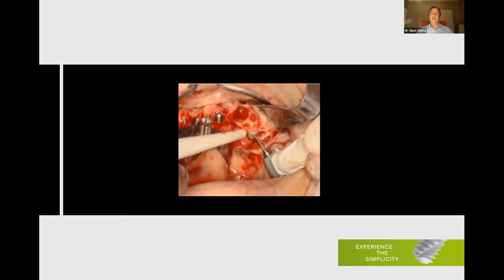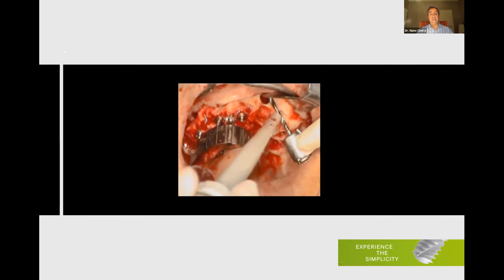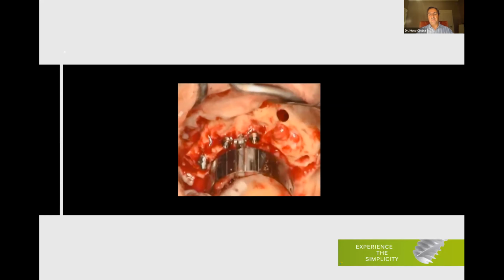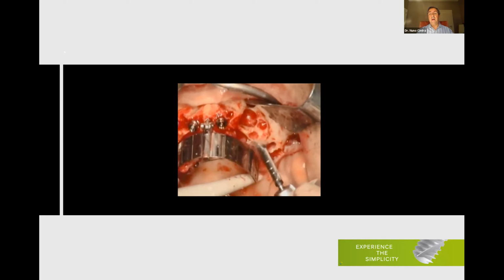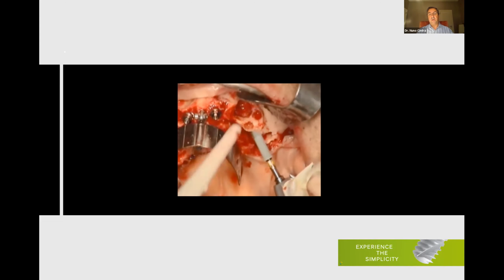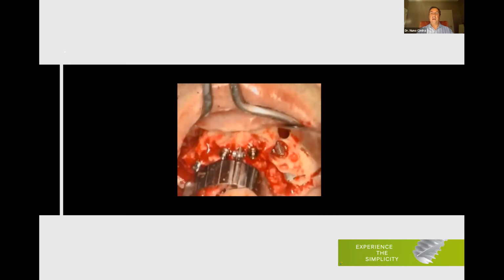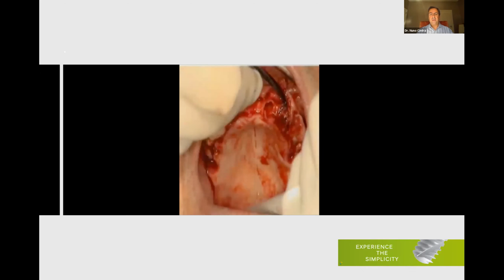And again, sometimes we need longer implants to do so. Sometimes to go through lesions, 16 or 17 length implants are not enough. We need 18s or 20s. As in this case, I'm using an 18 implant. So 45 degrees through the lesion. And when I say through the lesion, meaning that the tip of the implant should be above the lesion. We have to overcome the lesion. Don't leave the tip of the implant on the lesion, because otherwise you don't get good primary anchorage. You don't get good stability. Don't leave the implant there. Okay, you have to overcome the lesion. And after placing the implant, of course, we'll graft this region with the bone that we have available.